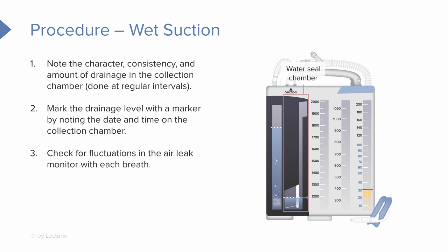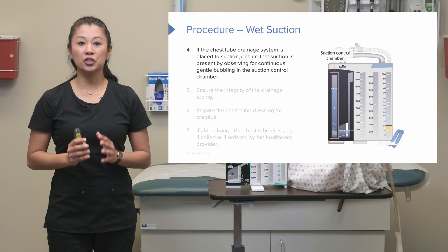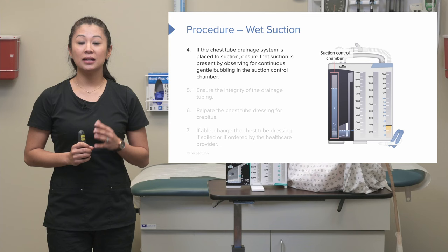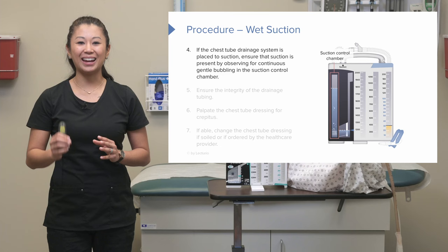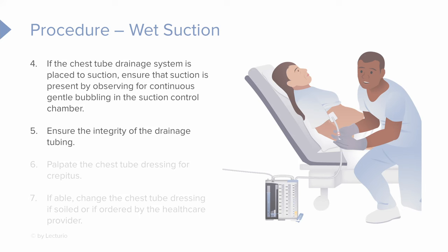Don't forget to check for fluctuations in the air leak monitor with each breath — this is a really important piece of chest tube monitoring care. If there's any air leak, this is where we're going to see it, so look for bubbling here. Now if the chest tube drainage system is placed to suction, ensure that suction is present. On a wet suction system, suction is controlled by the level of water, and we should see a little bit of bubbling in the suction control chamber — but not in the air leak monitor.